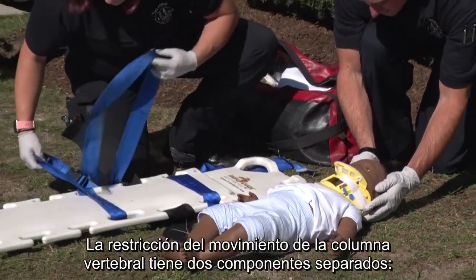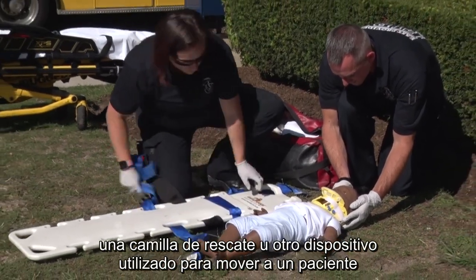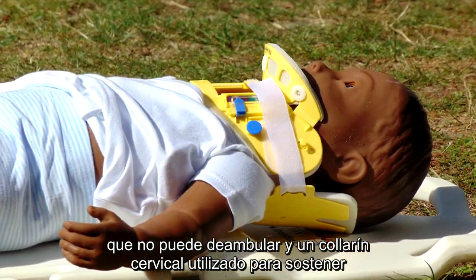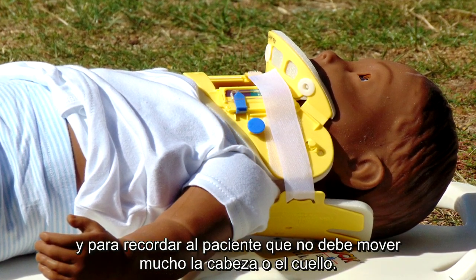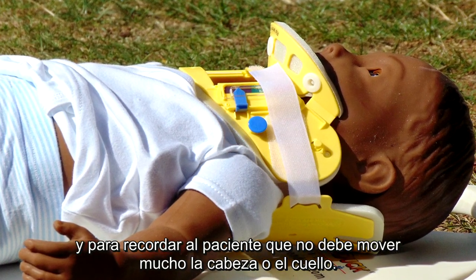Spinal motion restriction has 2 separate components: a spine board or other lifting device used to move a patient who cannot ambulate, and a cervical collar used to support a potentially injured or unstable cervical spine and to remind the patient not to excessively move his or her head or neck.